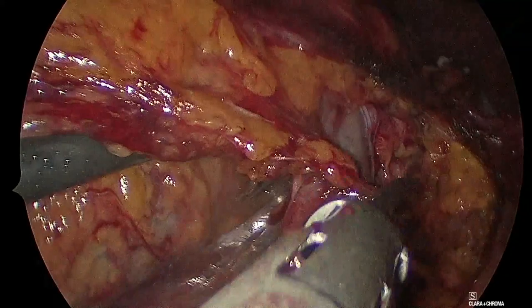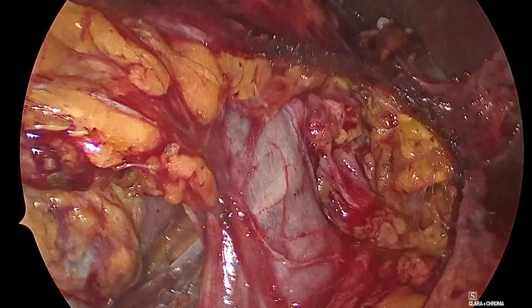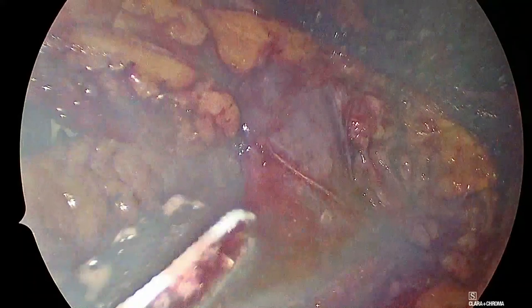remember that you need to make an incision. So I think that the best way to take the bladder cuff and the safest way not to leave any residual ureter in, which we know is very bad if it happens, is to do it open. So when I do an FRU, I do, like today, I do this part laparoscopically, and then the bladder cuff is always open for me. What do you do?